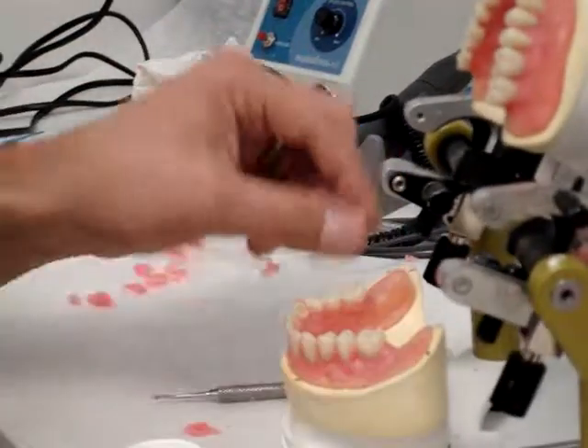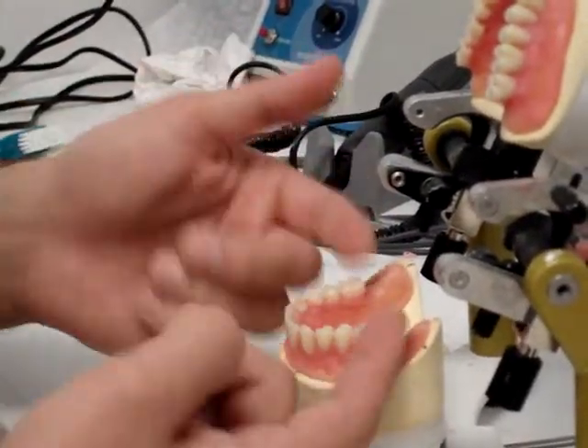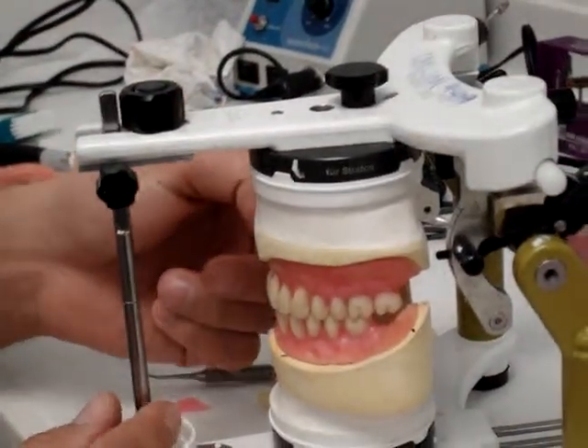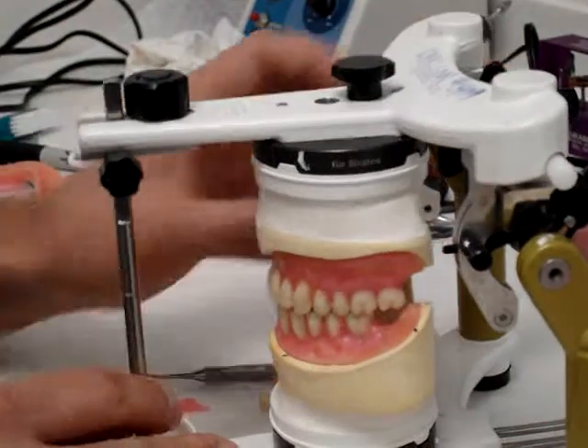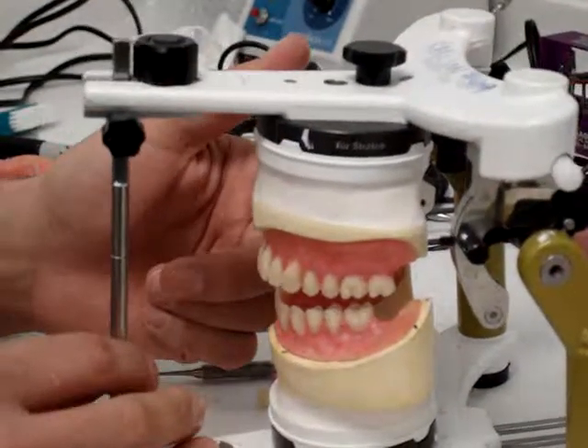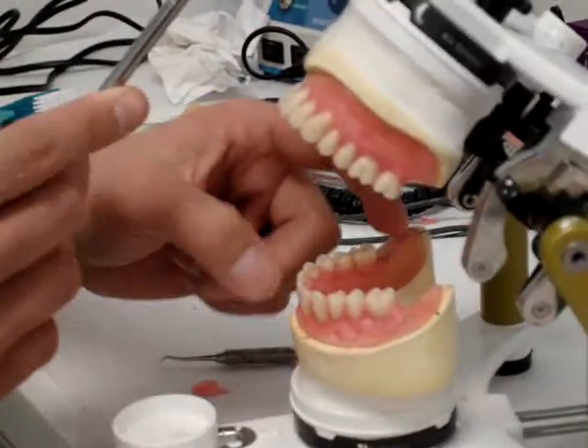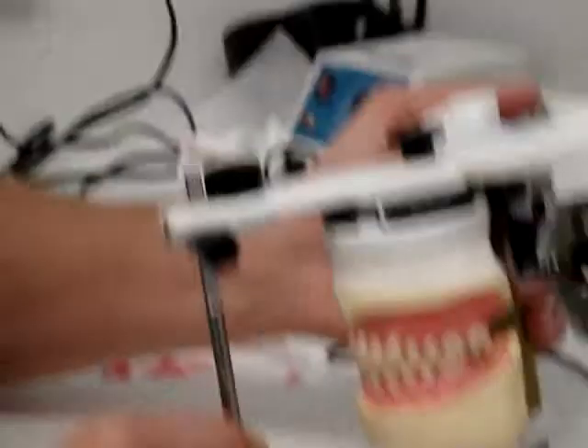The other reason why we set these last is because if they are high — which a lot of times they are — and then you're going into your working movements, one little point in the back can disclude your entire dentition, every tooth from that tooth forward. So that's another reason why I set them last.